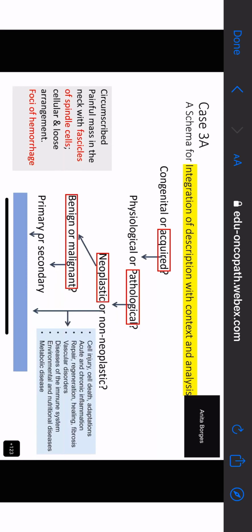Also, what has not been written over here, there are these distinct blood vessels which have a hyalinized collar. So now tell me what we are describing. What are we describing? Come on. We are describing a schwannoma, a benign neural tumor.